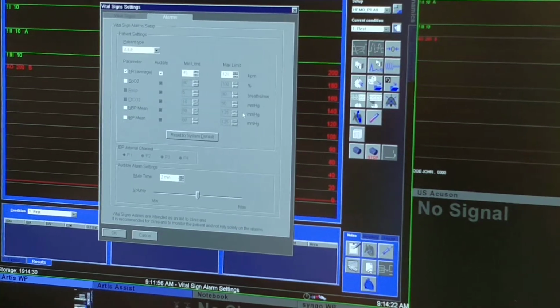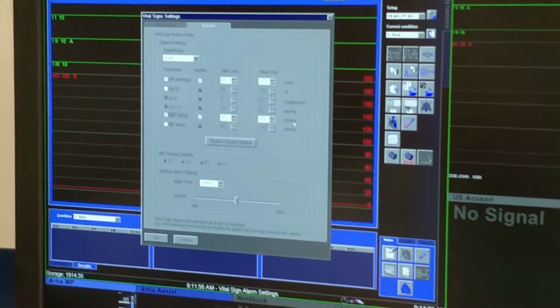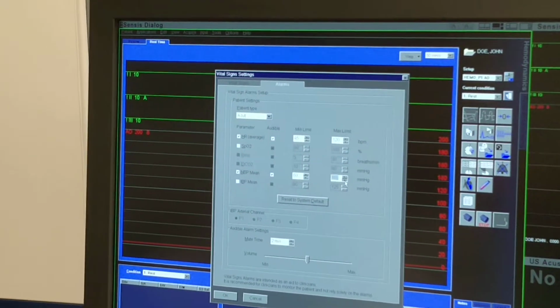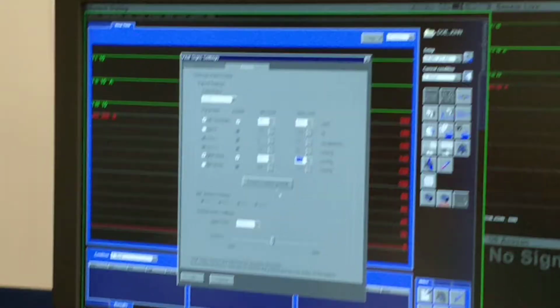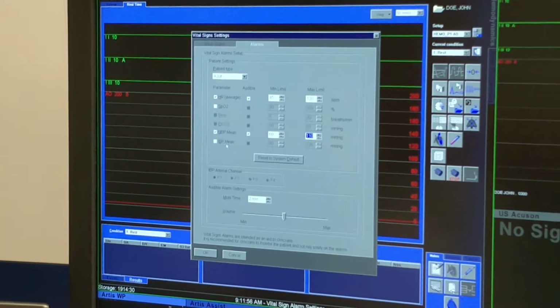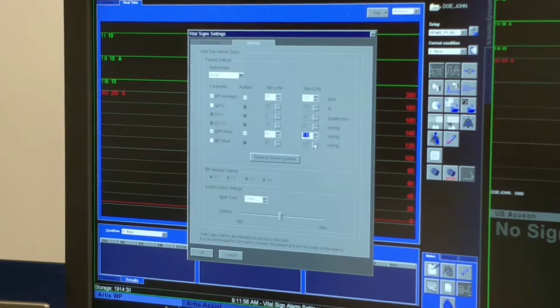It's extremely high. I agree with you. So you can actually change it. So we're going to click here. I'm going to go down here to 110. How about that? 110, are you happy with 110? Cool. Okay. I got the blink. That means it's good. So this is for non-invasive. You can also set up your invasive. Okay. So I'm fine with that.